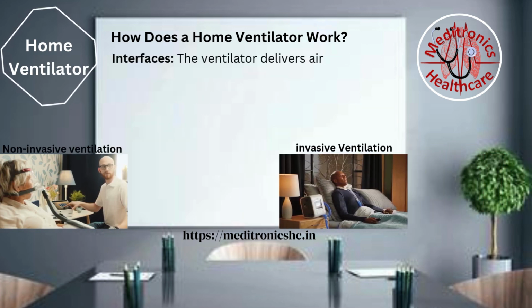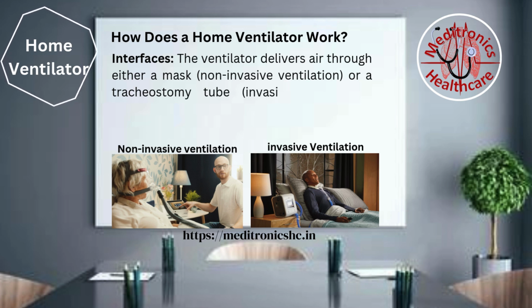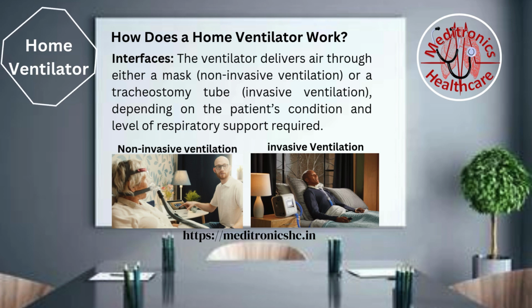Interfaces. The ventilator delivers air through either a mask (non-invasive ventilation) or a tracheostomy tube (invasive ventilation), depending on the patient's condition and level of respiratory support required.